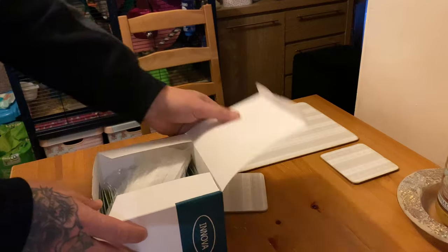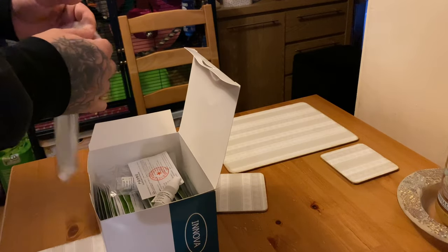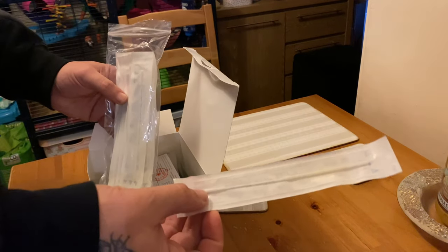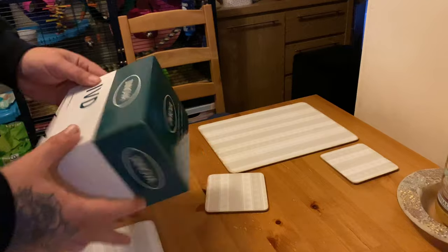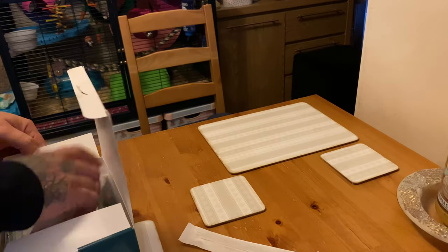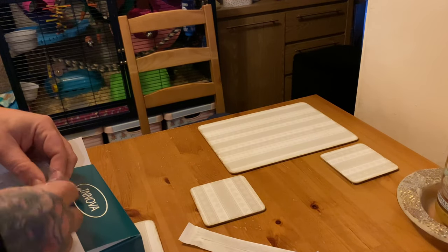The first thing we'll do is get what you need for a test. You'll need one of these tubes of fluid, one of the test sticks — that's it. Then we're done with the box, put it over there. Oh, you'll also need this little pocket container and then the little lid for it.